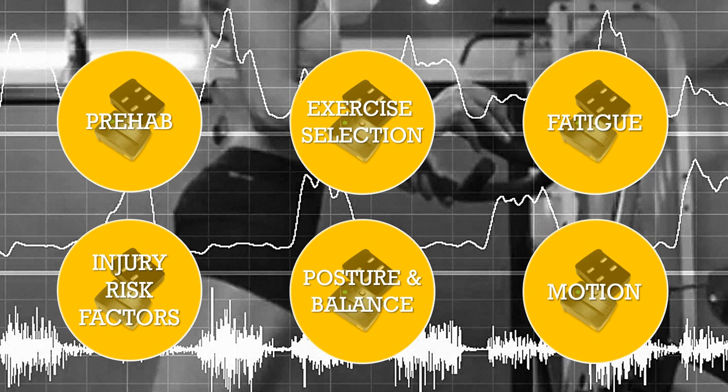So prehabilitation being the prevention of injury, identifying injury risk factors, which is, I suppose, a subdivision of prehabilitation, selecting appropriate exercises, so you can assess the muscle activity in response to different exercises and therefore pick the exercise that has the greatest recruitment of that muscle. So on the theory that the greater the muscle activity, the greater the muscle recruitment, and hopefully the greater the hypertrophy you would see in response to that activity.